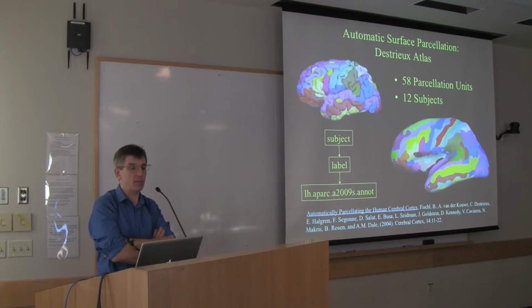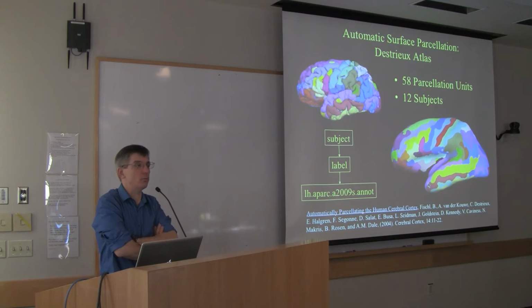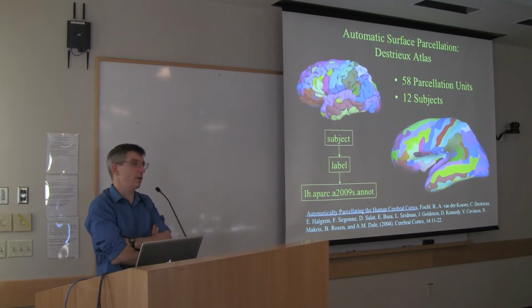On the other hand, it might be that you're really interested in something where the Desikan Atlas combines 3 of the Destrieux Atlas labels into one big one, and really what you're interested in is something that's smaller. And so in that case, you might have to go with the Destrieux Atlas. There are also ways to take these ROIs and divide them up into halves or thirds or quarters or fifths or whatever you want to do. So it's possible to slice and dice these things to customize it to something that you're interested in. But you should keep in mind that it's just geometric division.